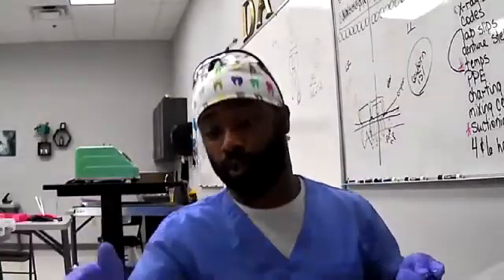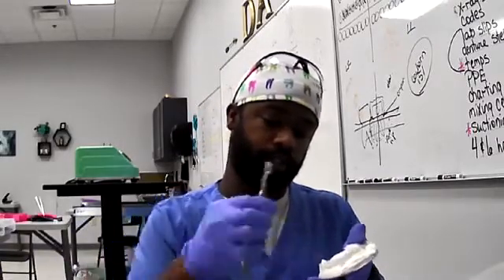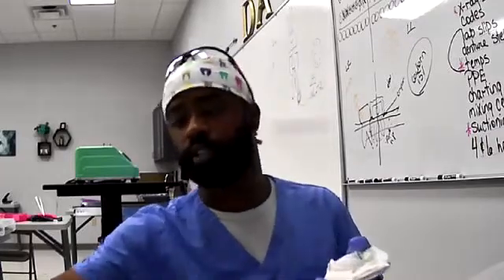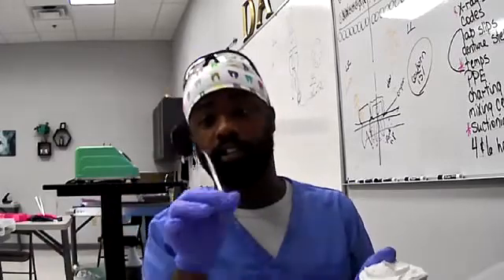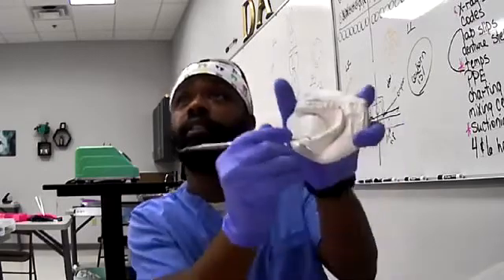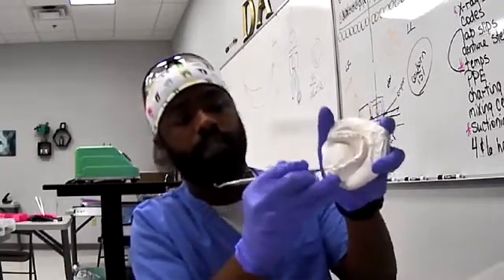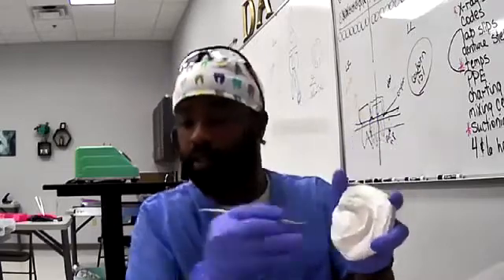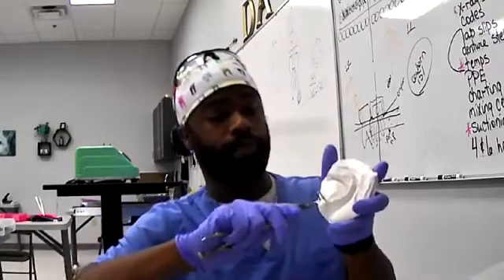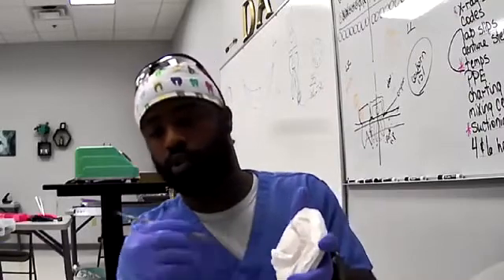So we filled the tooth. Let's just pretend like we feel that real good. Swap it over, put a little more in there. So now we got that. Now you take your packer condenser and they're gonna go into the tooth and they're literally gonna pack it into there. And it's gonna be a little pressure because they literally have to pack it good. Most of the time they'll go right back, scoop a little more, put a little more in there, pack, pack, pack it all real good.